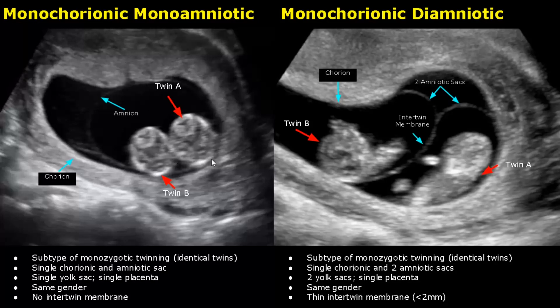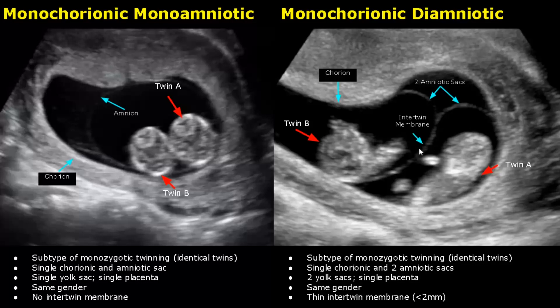The second subtype is monochorionic-diamniotic. It has a single chorionic sac but two amniotic sacs. Two yolk sacs will be found, but it will also have only a single placenta. The twins have the same gender — both will be either male or female. An intertwin membrane will be seen between the twins; it is made of two layers of amnion and usually measures less than 2 mm. Sometimes this membrane is very difficult to see.